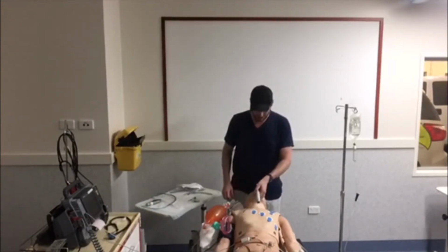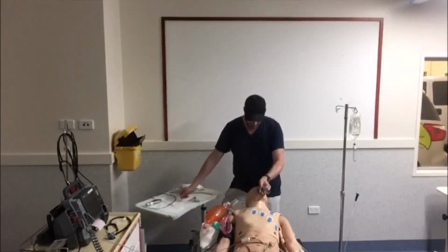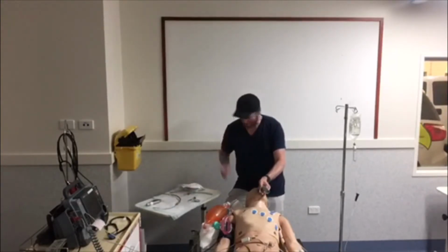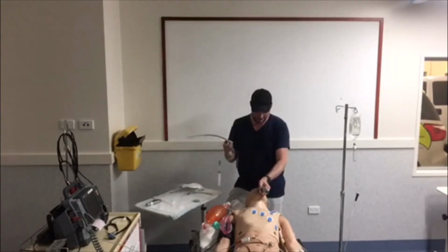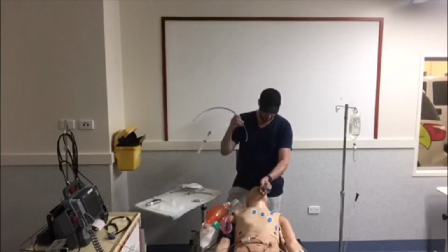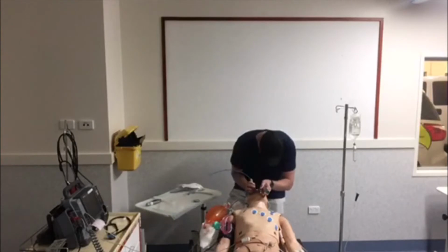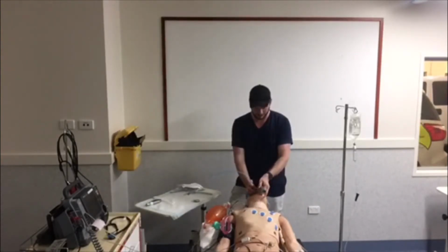So, pre-oxygenated patient, laryngoscope into the right hand side, sweep the tongue to the left, visualising those vocal cords the whole time, and getting my airway assistant to come over and give me that bougie. I've got this one pre-loaded with an ET on, just because it's a bit easier for me, since I haven't got an airway assistant. Visualising those vocal cords, bougie in, and then I can railroad that tube on by myself. Okay, I can just see the second mark now, and 22 at the lips. Great.